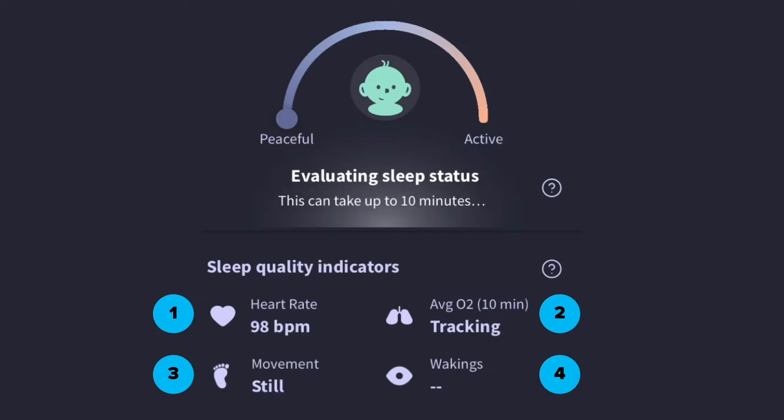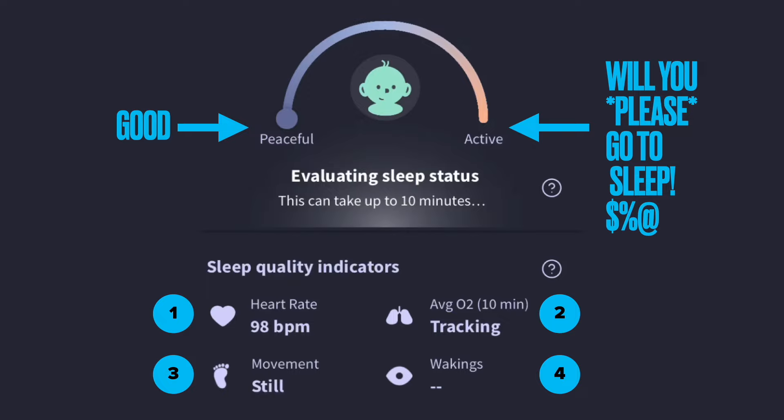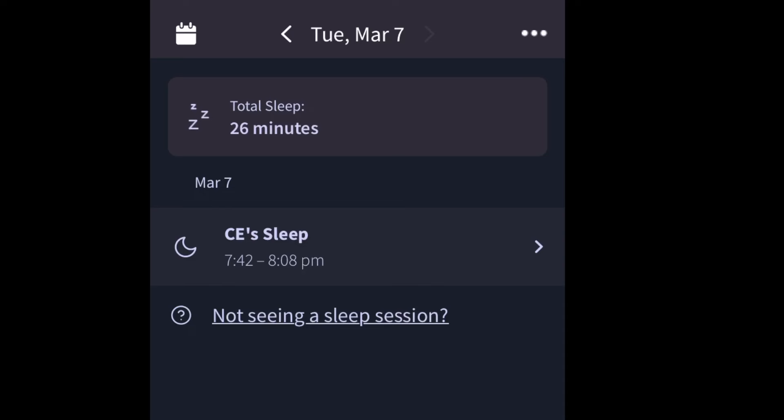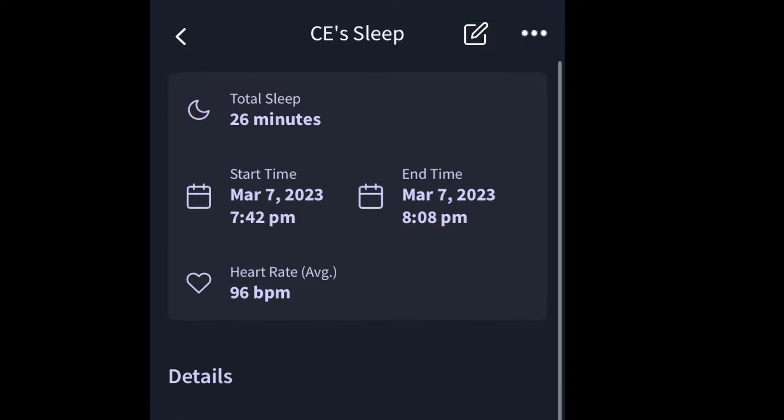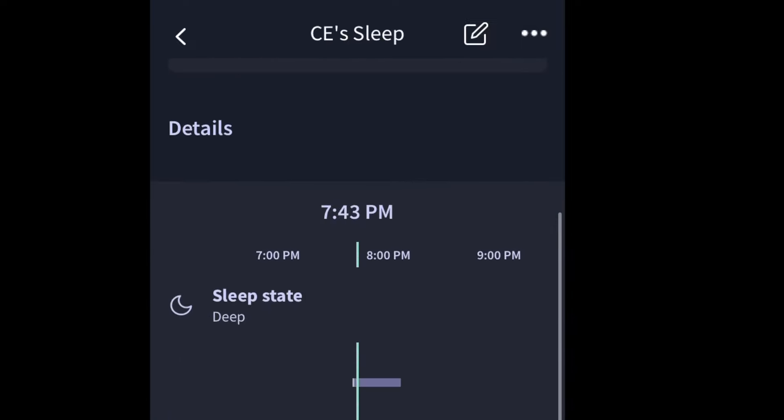It uses all of this to feed into its own decision engine to determine whether the sleep was peaceful — aka good sleep — or whether the baby was really active and getting poor sleep, in which case the parent is probably also having a bad night. You can go by day to see each sleep segment, how long it lasted, the heart rate, and in the graph details you can see the sleep status change from light to deep. It takes all those indicators, puts them together, and shows your baby slept lightly, then deeply, then lightly, then deeply, and so on — or deeply, and woke up really happy, which would be great.